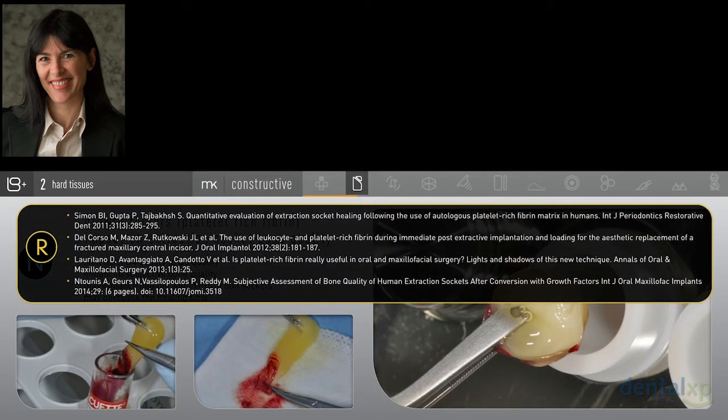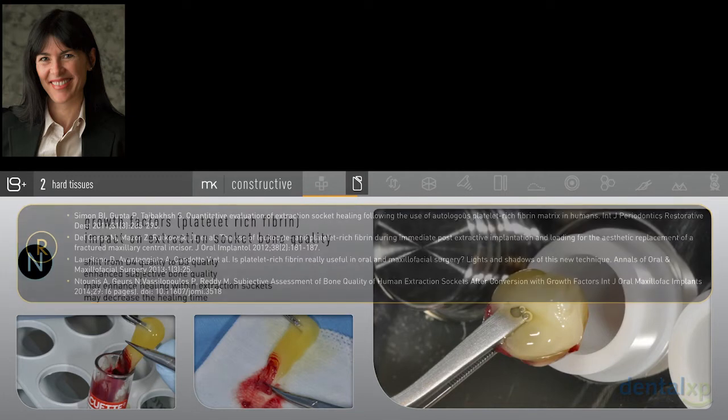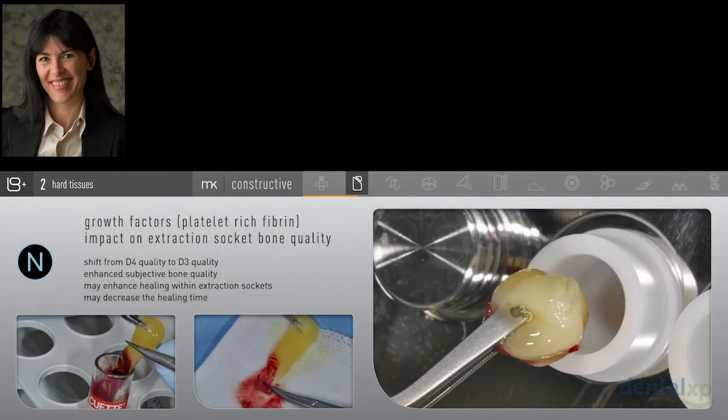Ridge preservation is such a valuable tool, but we realize that even in ridge preservation, what we do today continues to change. In my history of what I've done, I have moved through the gamut of materials. I've moved from autogenous materials to biologics to more and more building in growth factors, whether they're autogenous or made by recombinant technologies, because we're looking for ways to make bone volume better. We're looking for ways to make bone quality better as well.